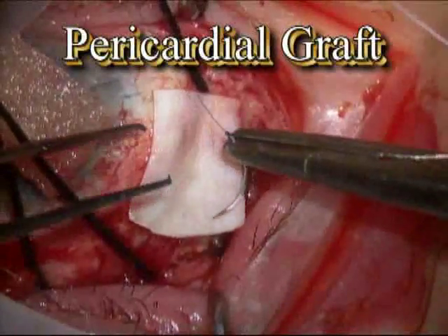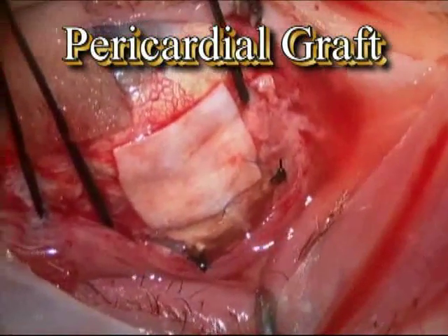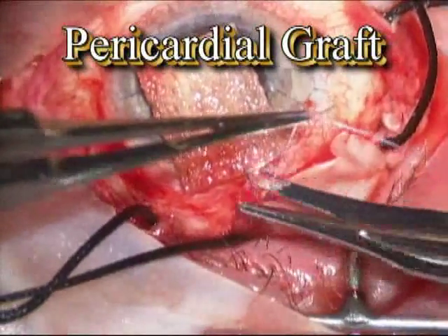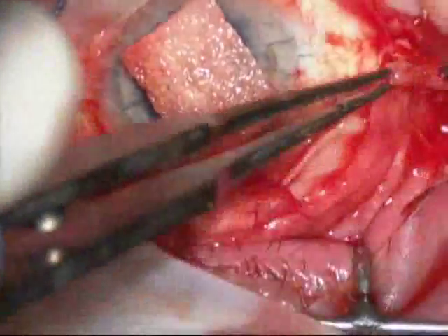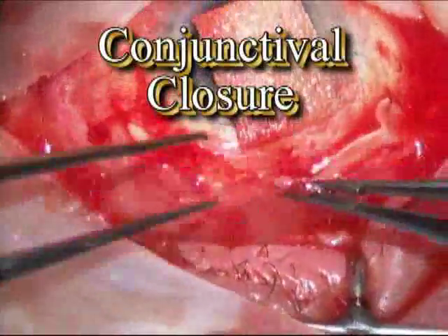Towards the end of the surgery, a pericardial graft is placed over the tube to keep the tube from exposing. It's sutured in all four quadrants with a Vicryl suture, which is reabsorbable. All the sutures left in the eye at the end of this surgery reabsorb within usually a month or two and are all covered, so the patient is not uncomfortable.